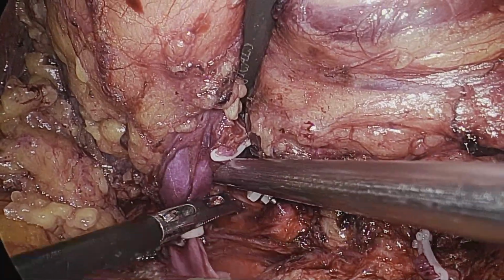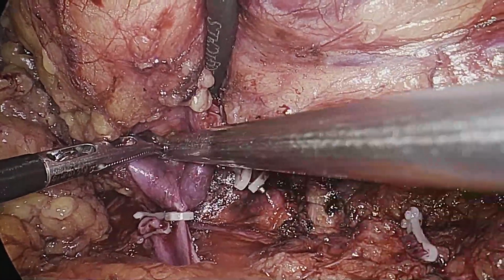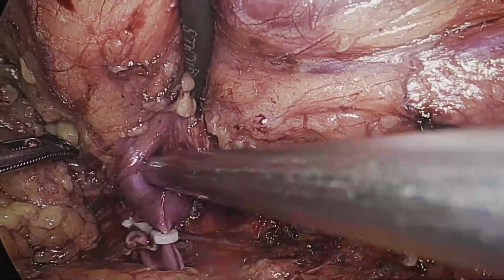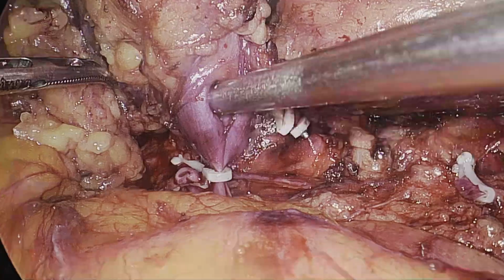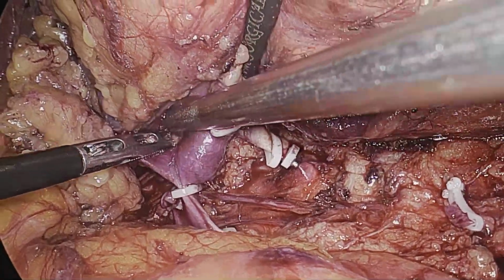Then to apply the distal clips, the vein was splitting into two just at the hilum. So we decided to separate and apply separate clips at the specimen side.